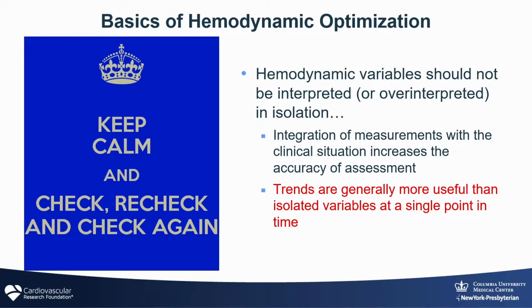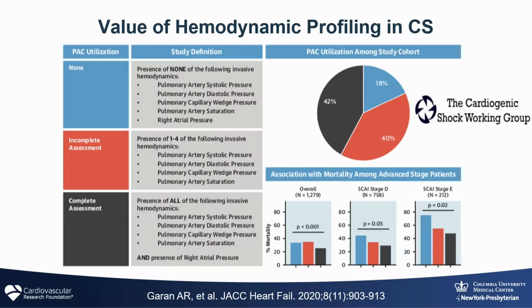You can overreact to numbers and overreact to them in a deleterious fashion. The trends are usually more useful than single point measurements.